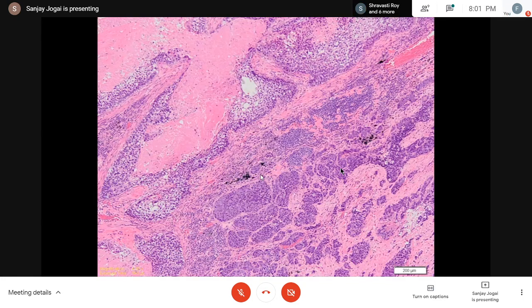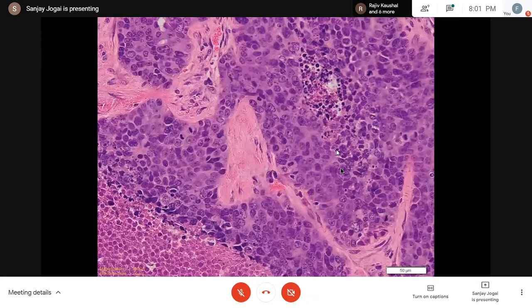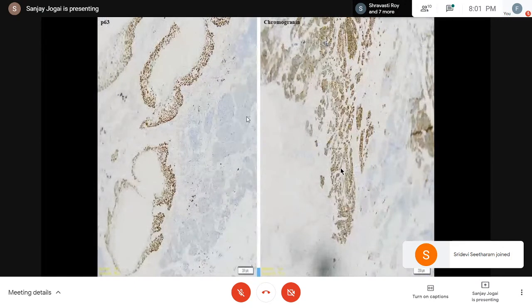So this is how the lobectomy looked. It's almost reminiscent of the previous case to some extent. You have areas here which are highly necrotic with slightly more cytoplasm, whereas cells here look more organoid, more bluish, with a neuroendocrine look. We go in at high power and you have similar spindly cells with a stippled chromatin pattern. And there are other areas where the cytoplasm is more abundant, the cells have started becoming nucleolated. You have got geographic necrosis, a lot of apoptosis there, and again immunohistochemistry.